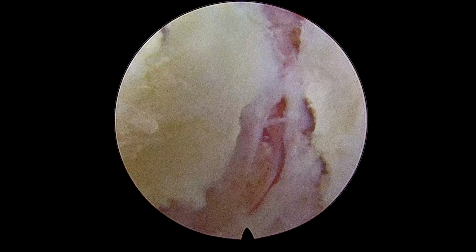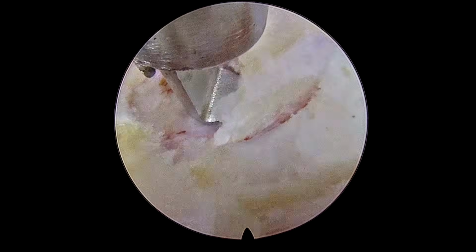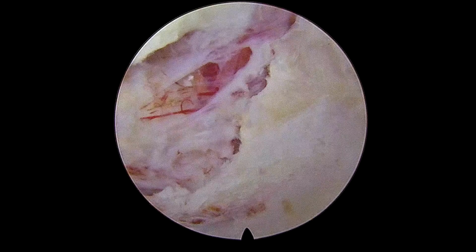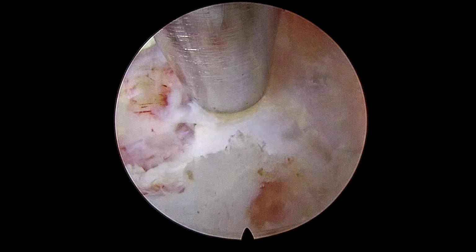In the cervical spine there is always an epidural membrane over the dura. You can see here the neural structures are not very clear. That is because of the epidural membrane here. So we'll just remove the thinned out margins of the lamina. This is the superior margin of the inferior lamina.